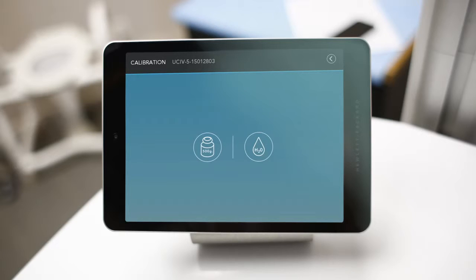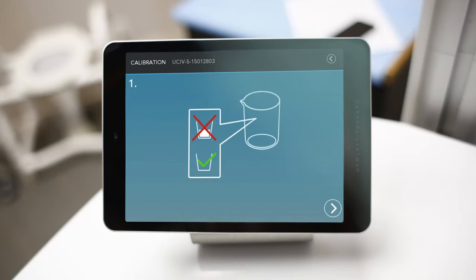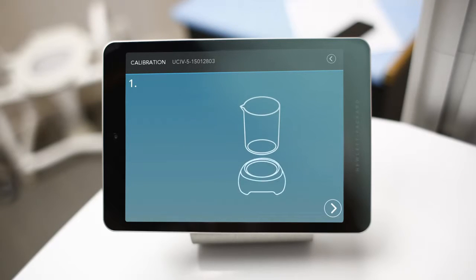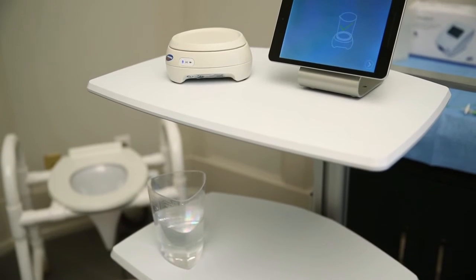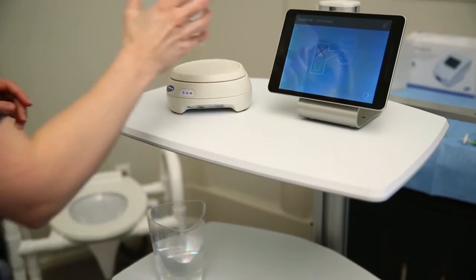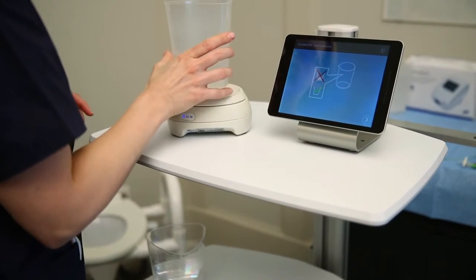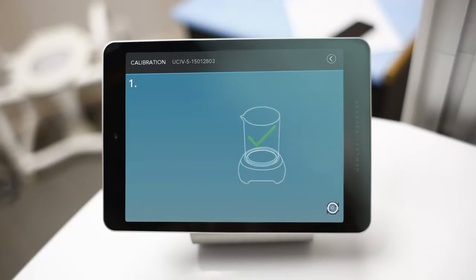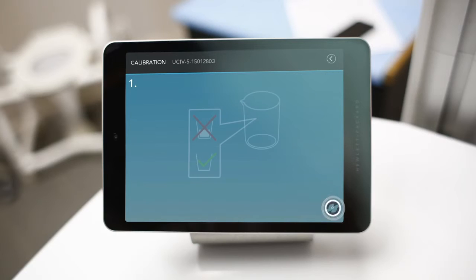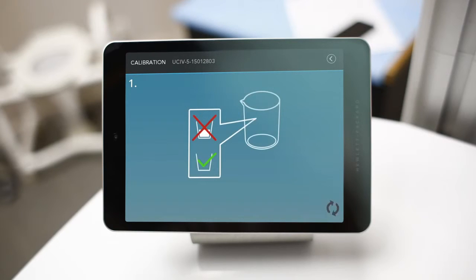Next, following the on-screen instructions, lightly place a beaker on the Eurocap 4. Once placed, tap the arrow icon in the bottom corner to move on to the next step.